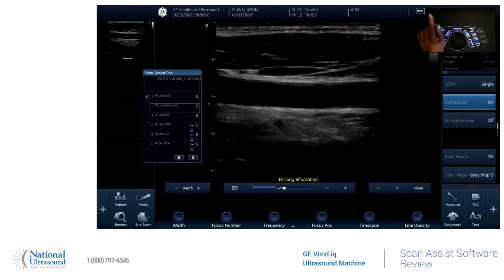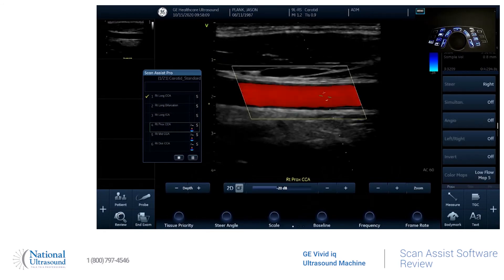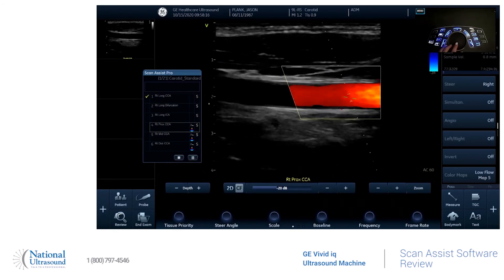And if you want to skip a step, all you have to do is just click on to the next one, and it'll change on to the next step. When you go to a step that has color and Doppler, it'll automatically bring it up for you. So the color is already there. The Doppler is already there.